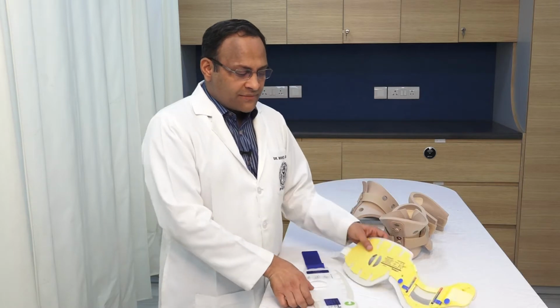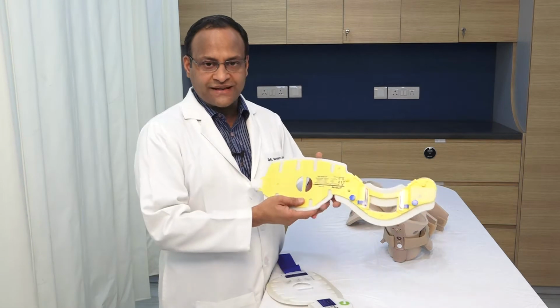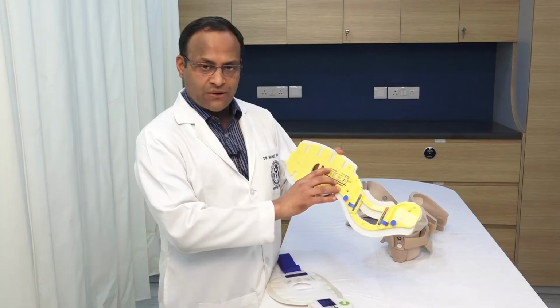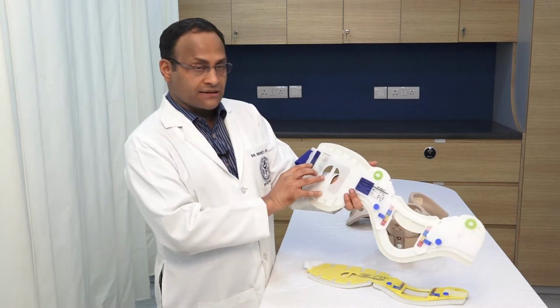Now the one which comes as an adjustable collar comes in two varieties. One is for pediatric use, and it's written here, that's the mini one. And the other one is an adult one, which is again mentioned here, it's for an adult.